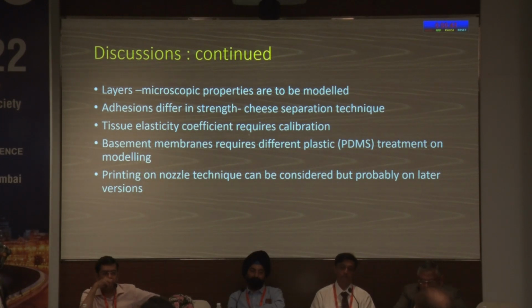In the layers, microscopic properties can be introduced, like lower endothelial count, like a previously traumatic cornea. Adhesion properties can be incorporated. Tissue elasticity coefficient can be incorporated, but it requires calibration. Printing nozzle technique can be considered, and bioprint can be considered.